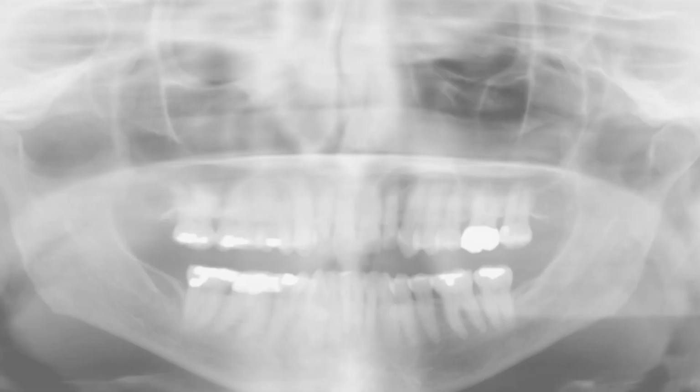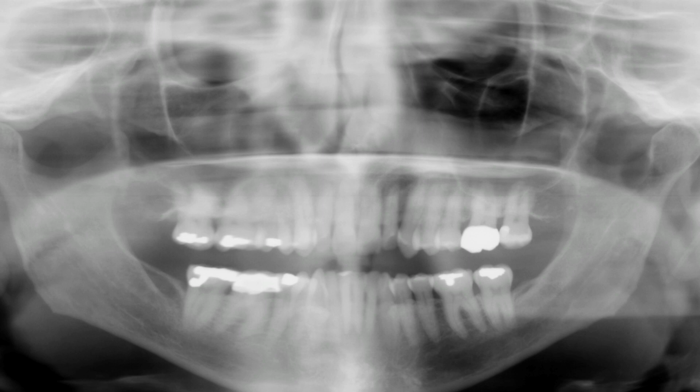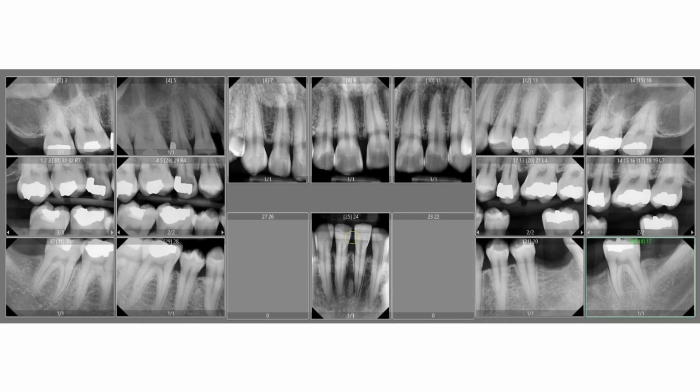In today's video, we will be discussing charting. Depending on the office you work at, you may be responsible for charting existing treatment on your own or assisting the doctor with this. If you are responsible for this, you should start with any x-rays, intraoral photos, and complete a visual exam of the patient's mouth.